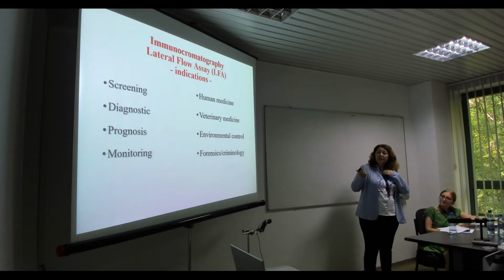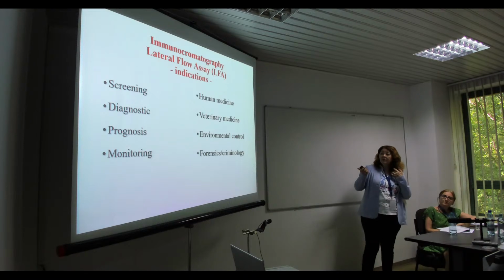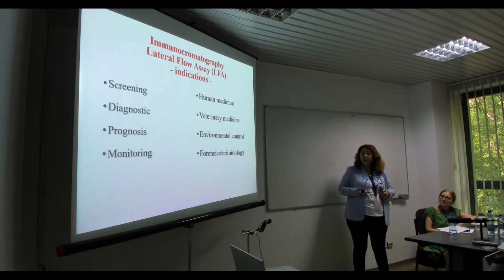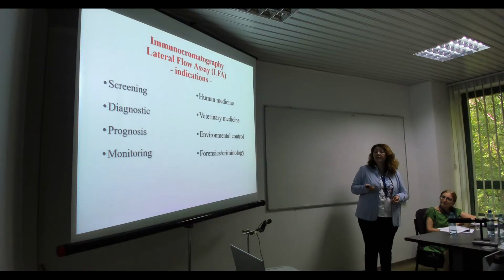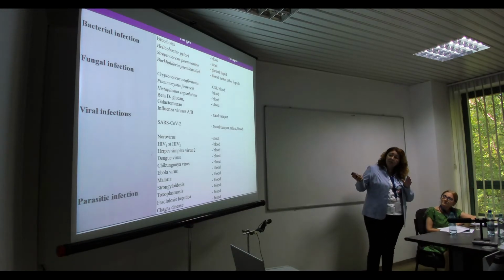And the indications are not only for human medicine. We can use it also for veterinary medicine, environmental control, forensics, criminology, for screening, diagnosis, prognosis, monitoring. So we can use the immunochromatography lateral flow assay in many other domains.